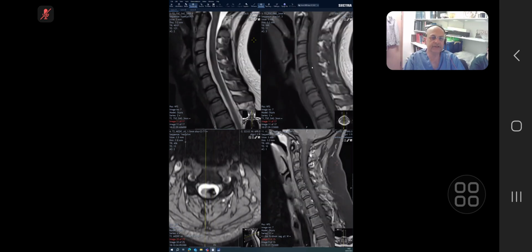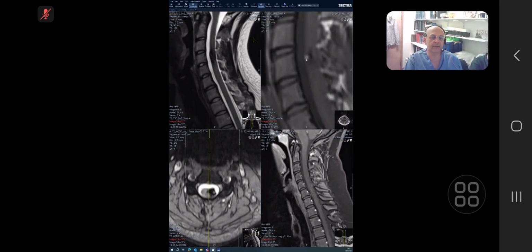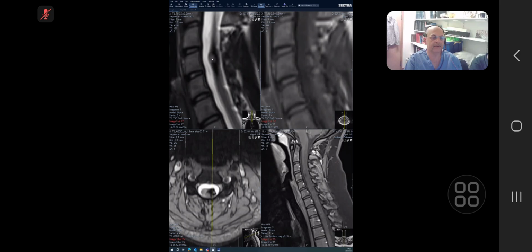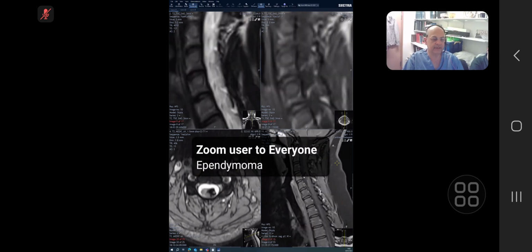It is a lesion which is low T1, with marginal central T1 high signal. It has a hemosiderin low signal with a bright T2 center and a complete hemosiderin rim. It is occupying the left half of the cervical cord at C4 level. It doesn't show any avid enhancement.